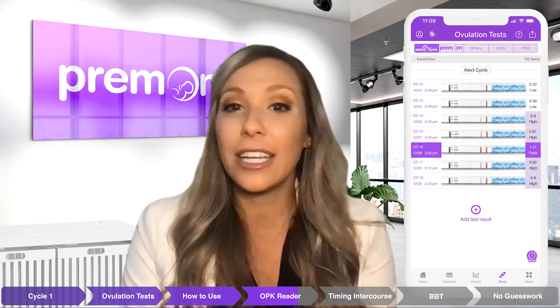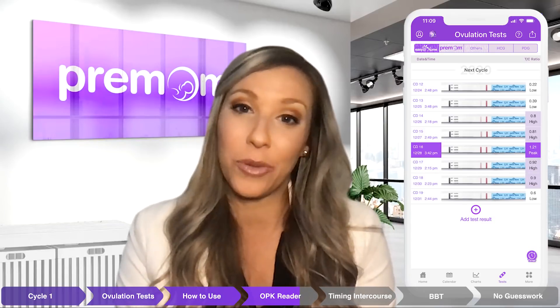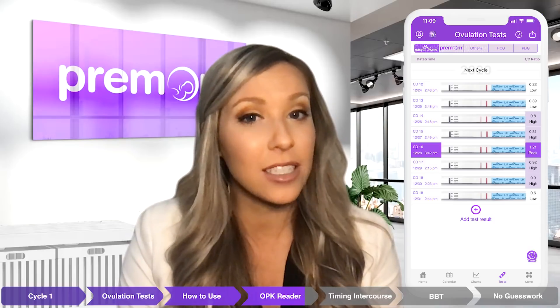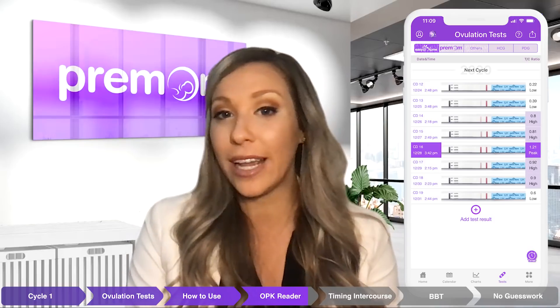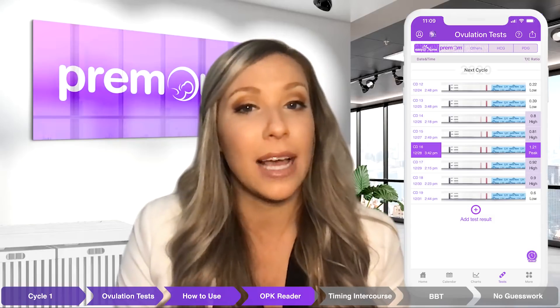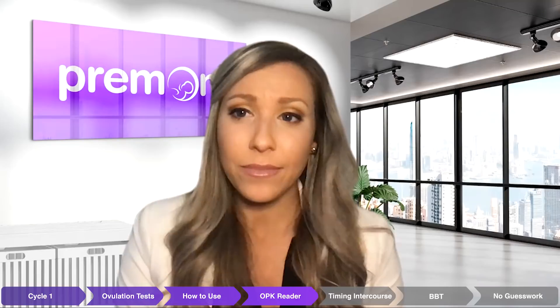After LH peak, you'll notice the lines will get lighter and lighter each day as your fertile window closes. The more you enter ovulation tests, the more the premium app can learn about your cycle and better predict your fertile window for future cycles, allowing you to time intercourse appropriately and get pregnant quickly.